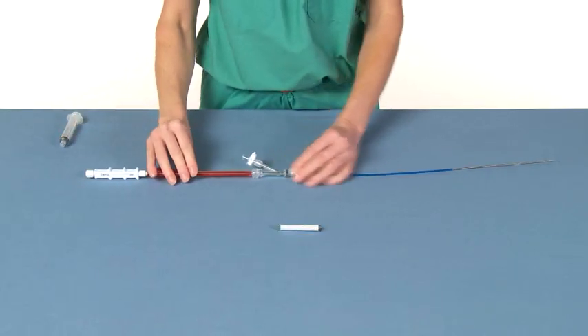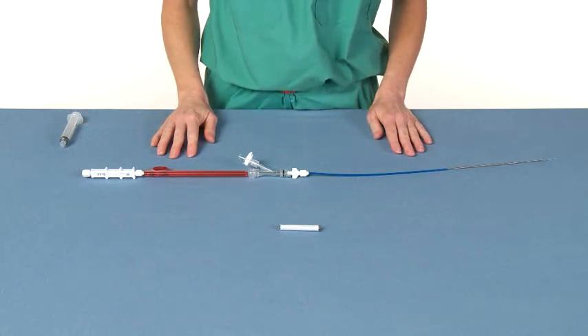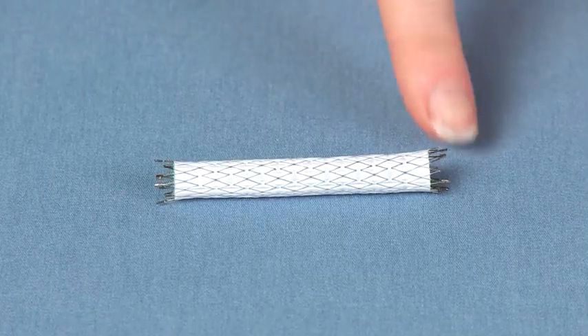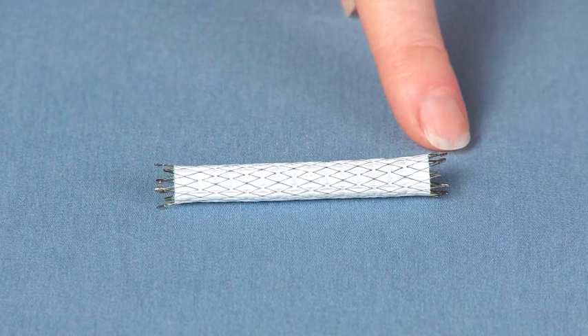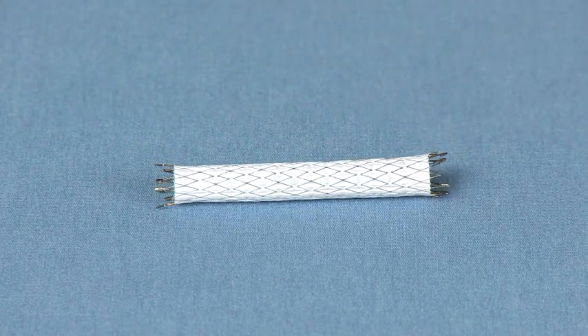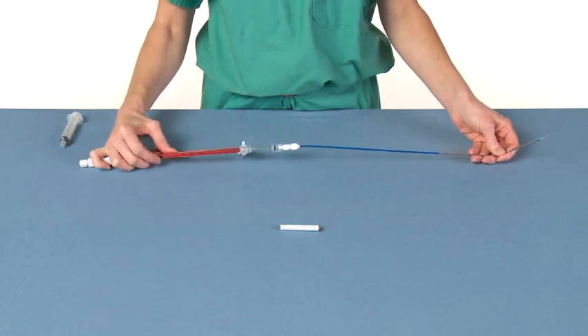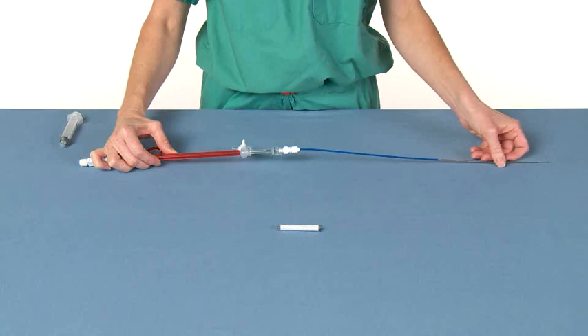The Fluency Plus tracheobronchial stent graft is now prepped and ready for delivery. Under radiographic guidance, the operator should advance the stent graft across the lesion. Use the radiopaque stent graft ends to center the stent graft across the stricture. Advance the stent graft beyond the lesion and gently pull back slightly on the entire system to position the stent graft accurately and remove any slack from the catheter.